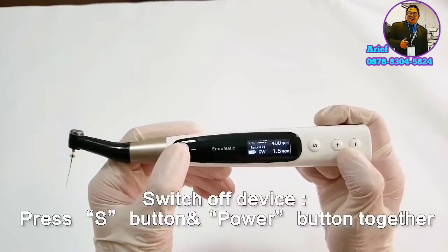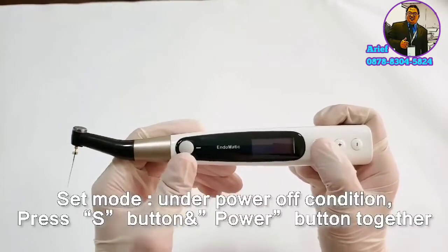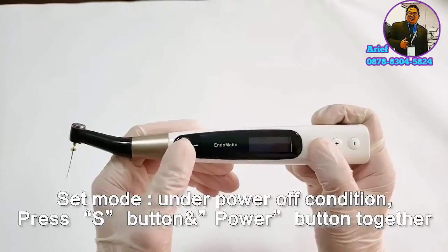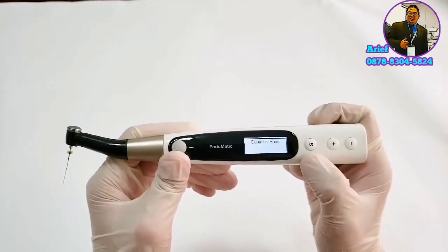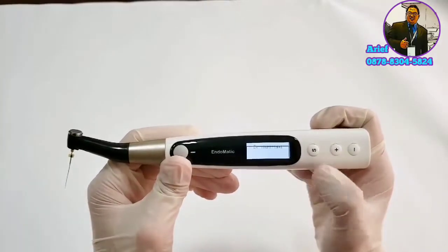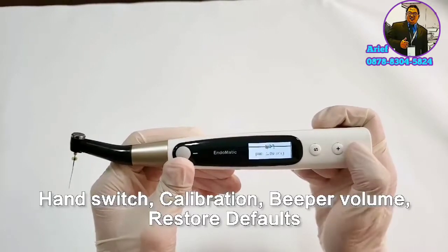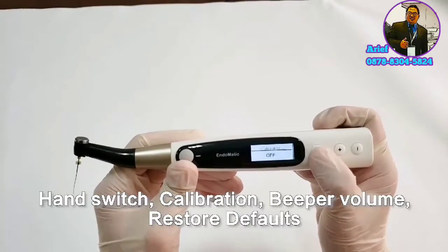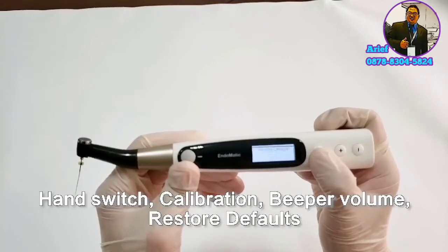There are also some small functions. Switch off the device and press the S button, then press the power button to access them. These include left and right hand switch, calibration, beep volume, and restore defaults.